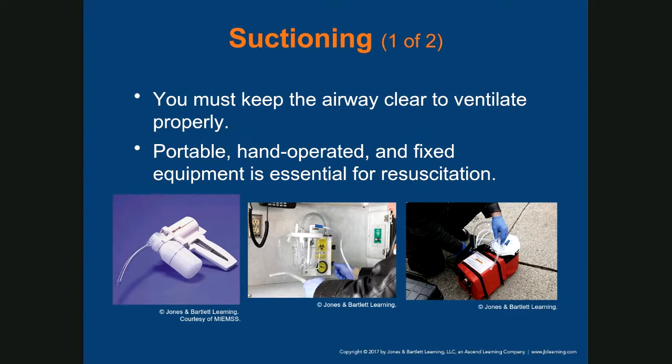Now, suctioning. If there is fluid in the airway passage, we may be required to clear that secretion. And you have different suctioning devices. You have your portable handheld suction, and you have the fixed mounted suction, which is on the unit.